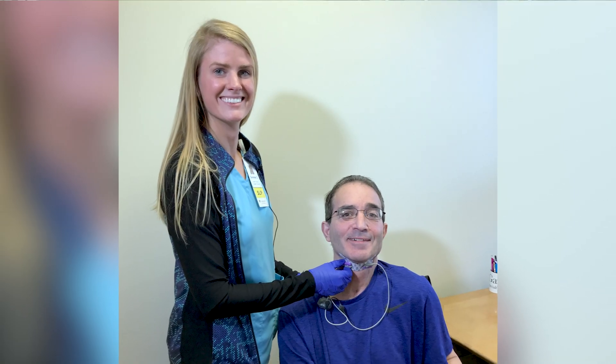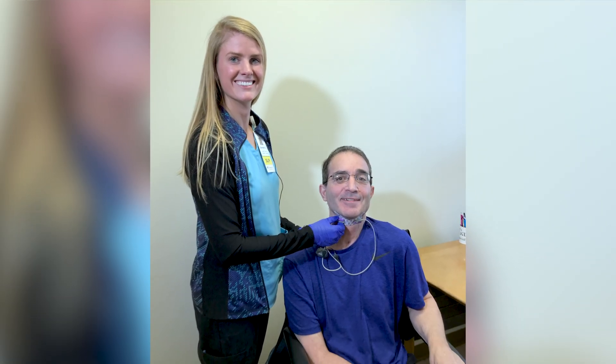One of my patients, Steven, has been working with me utilizing the Synchrony Swallow system for quite some time after a brain stem stroke, and he's had a remarkable recovery. He's now eating a primarily regular diet with thin liquids by small sips as he can tolerate them. He is such a hard worker, and I think this system has really helped motivate him throughout the long period of therapy. This engaging system, which can constantly adjust to meet the patient's level, has really helped him improve his swallow.